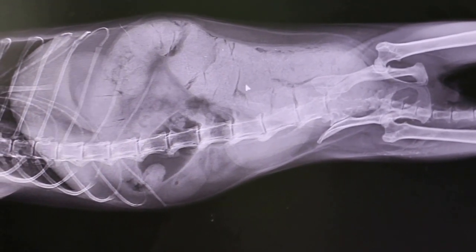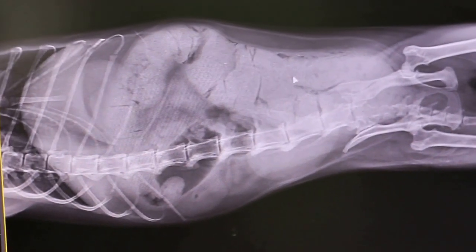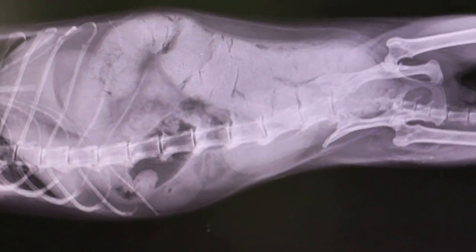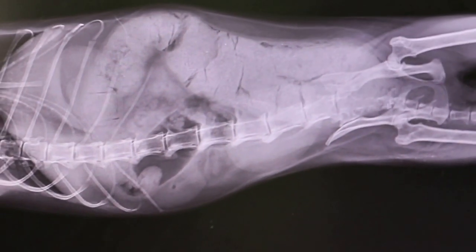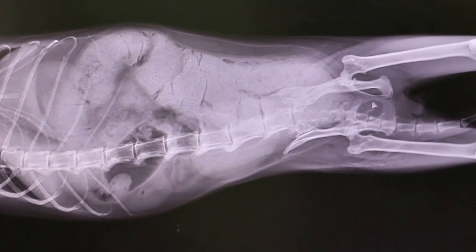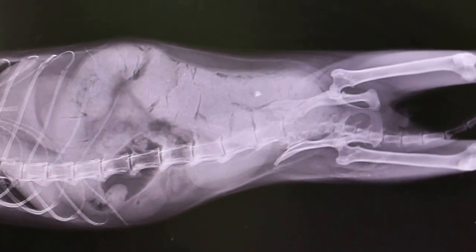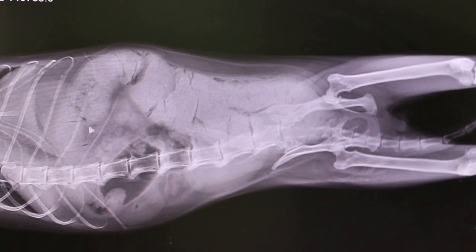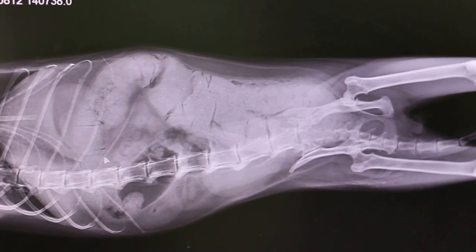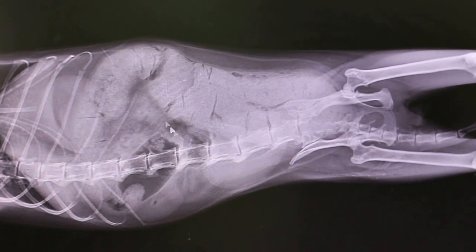You can feel it — the biggest sausage you'd find in a supermarket, that's about the size. And this is where the diarrhoea comes in — a very smelly, loose diarrhoea here. So the ventral dorsal view illustrates very well the extent of the constipation, from the transverse colon to the descending colon.